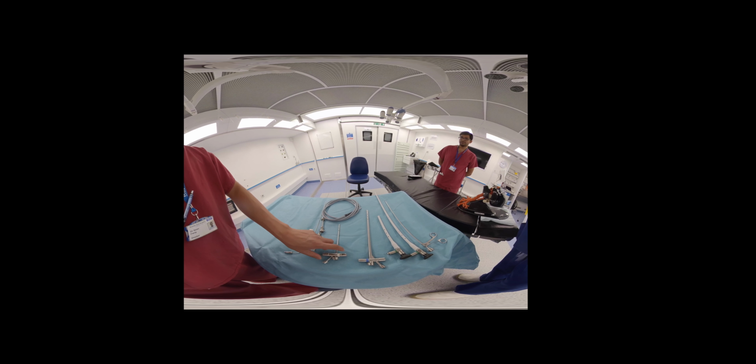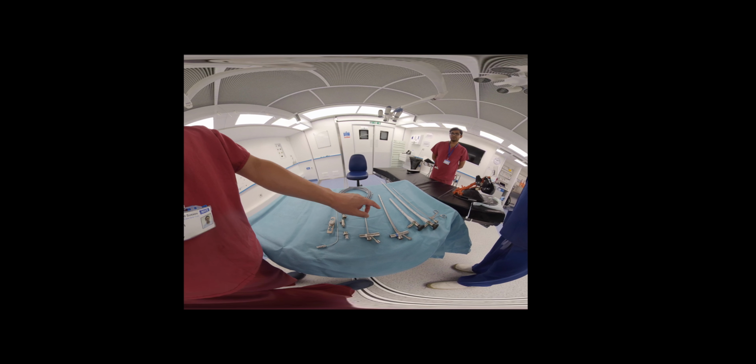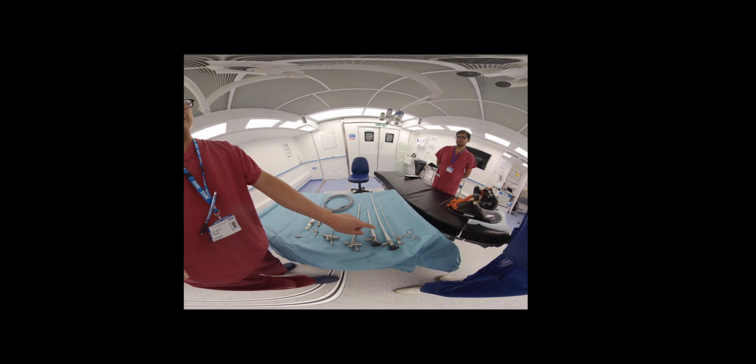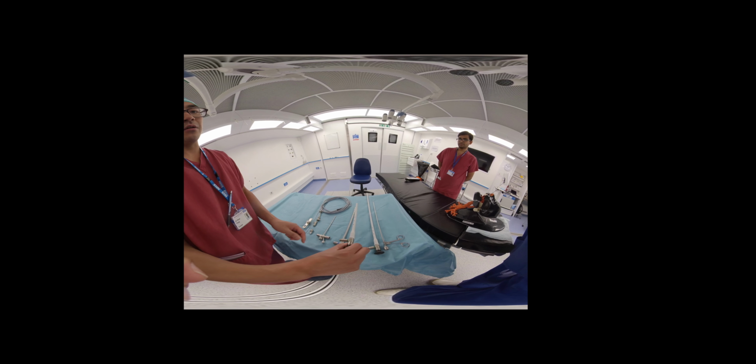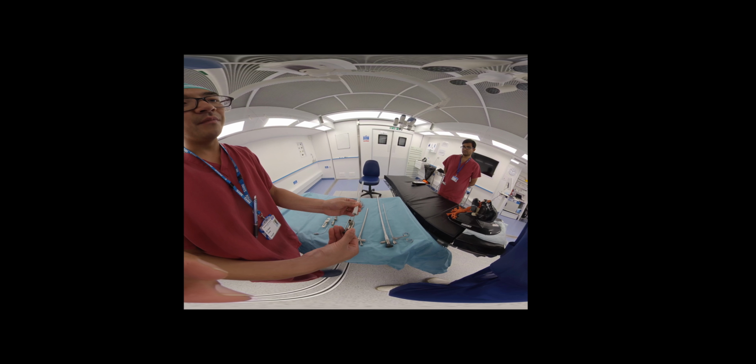Okay, so this is a very small one. This is a size 2.5. And so the smaller, shorter bronchoscopes require a shorter 0-degree Hopkins rod. And these are the Hopkins rods, or the endoscopes. They come in a plastic sheath. You just rotate them and then pull them out.